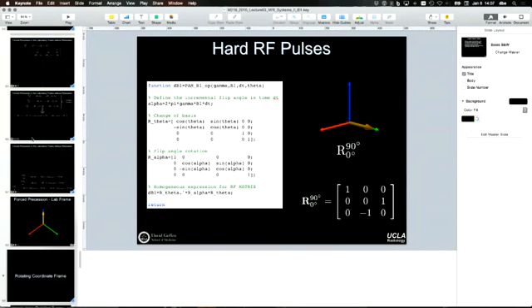I think what's partly causing confusion at least is that we're used to thinking about right-hand rules and whatever, but the action of a B1 field on a magnetic dipole is left-handed. Okay. And so we have to work from that. Okay. Starting, and then your thumb is the start.